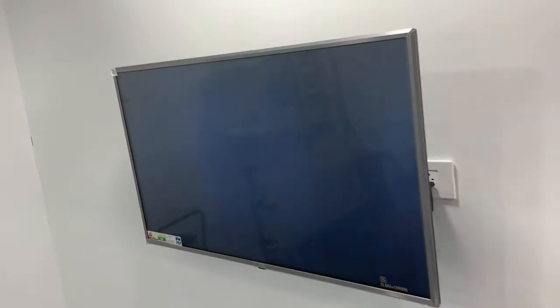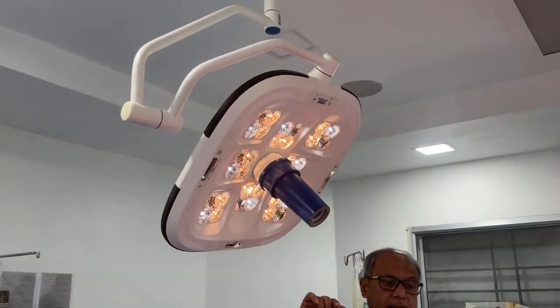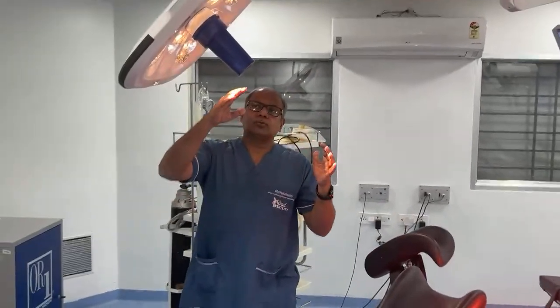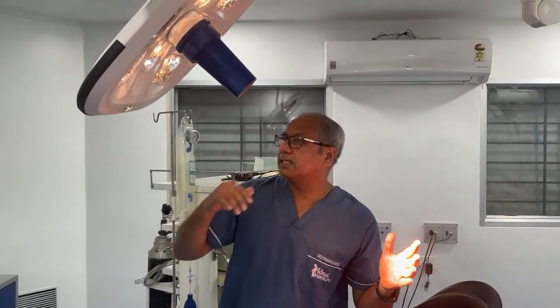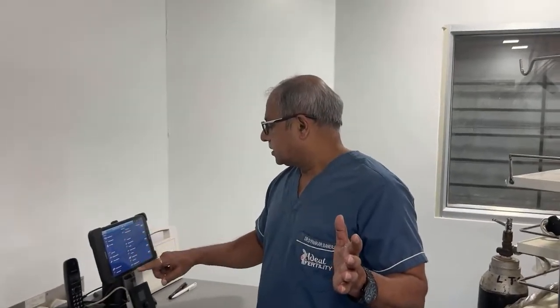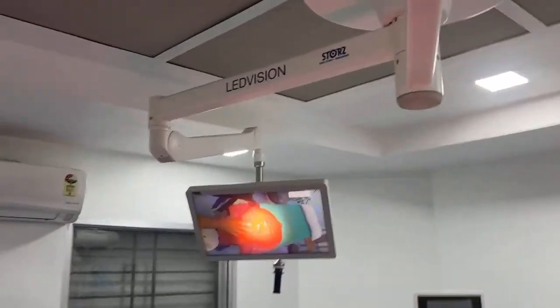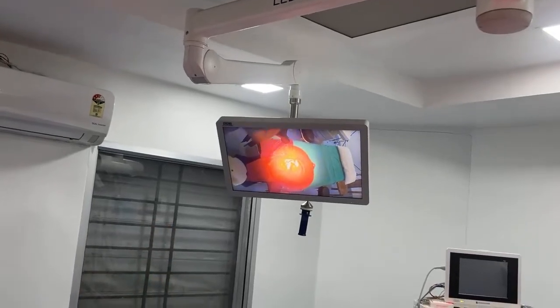Now there is another system, the OT light, and there is a camera here also. If I am doing open surgery and I want to telecast it to our different zones, I can use this OT light camera. For demonstration, the OT light camera can be switched in place of the endocam. Then if I do some work here, it can be transmitted to this screen.